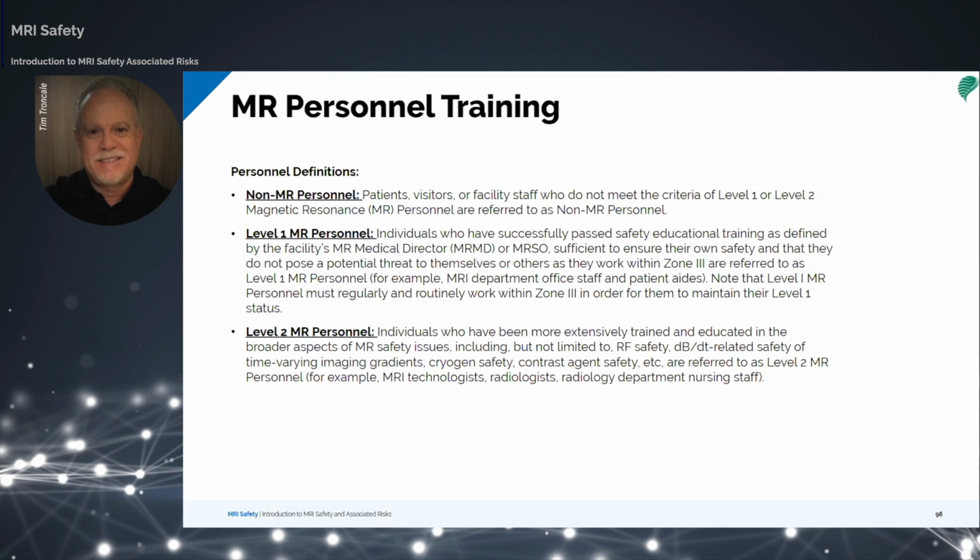Some tech aides are even trained to the next level, which is level 2 MR personnel. Individuals who have been more extensively trained and educated in the broader aspects of MR safety, including but not limited to the static magnetic field, radio frequency, gradient fields, cryogen safety, contrast safety, many of the things that we have discussed today. This would include, of course, the MR technologists, radiologists, department nursing staff, and as I mentioned, some tech aides.